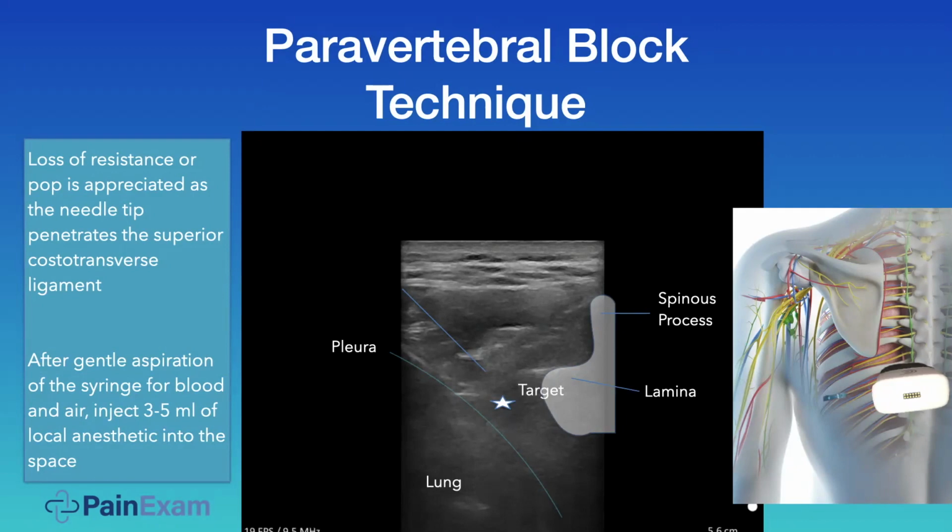And I've done many of these in the office. I've never seen any sort of hypotension. I'm not saying it won't happen. Have monitoring, have all your equipment there. I've been doing this for a very long time, and I'll do multiple paravertebral shots. I give a total of sometimes 10 mLs of 0.25% bupivacaine.